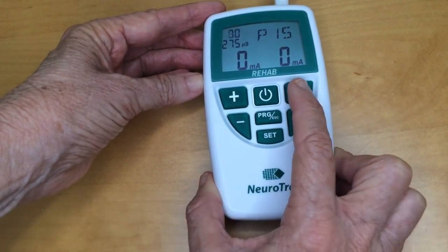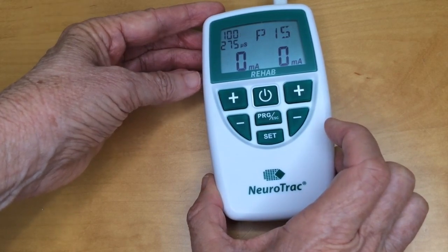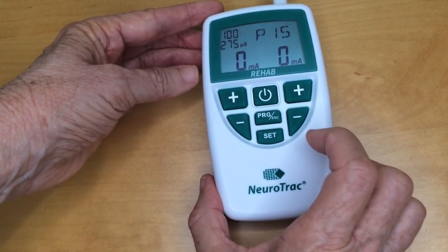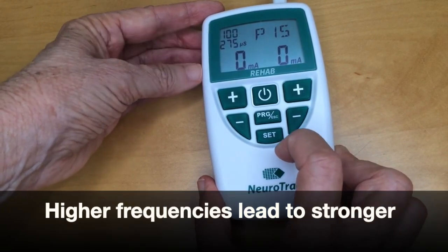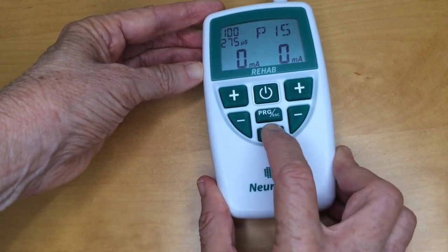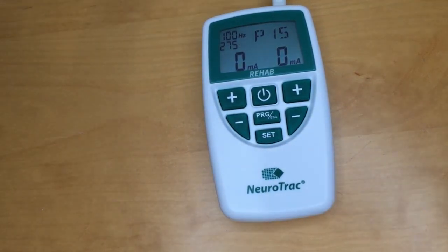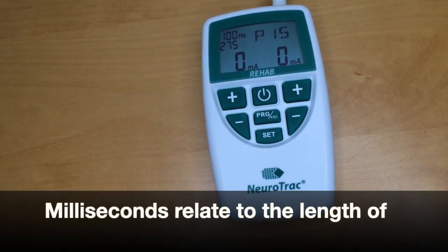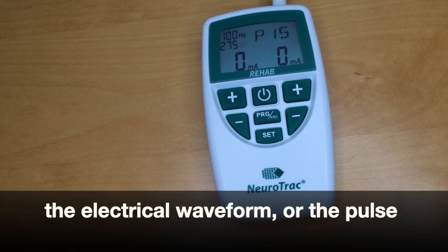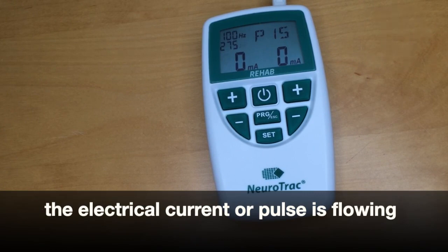I'm not setting it up as I would for a client — I'm just showing you how it would work. When I'm ready, I push set again and move on to the next parameter, which is milliseconds. Milliseconds relate to the length of the electrical waveform, or the pulse width — that's the time span that the electrical current or pulse is flowing.